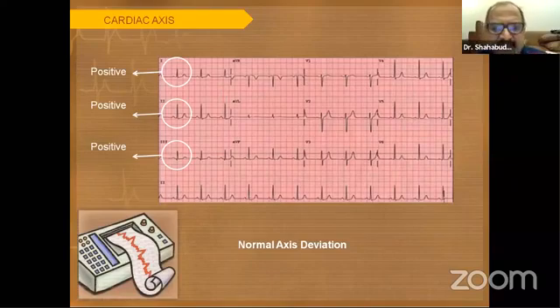Finally we can see some examples of cardiac axis in lead 1.